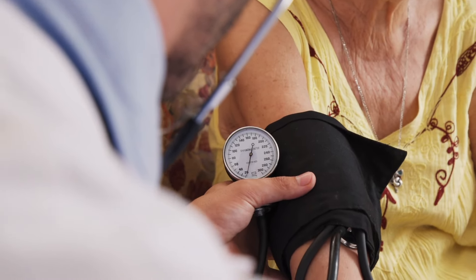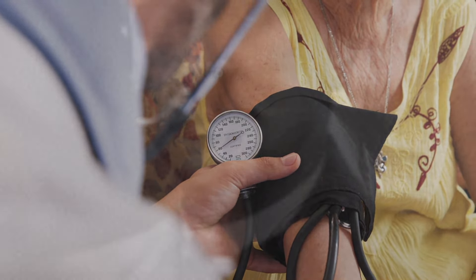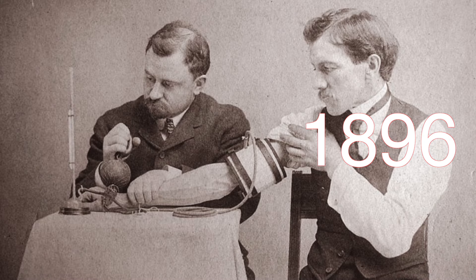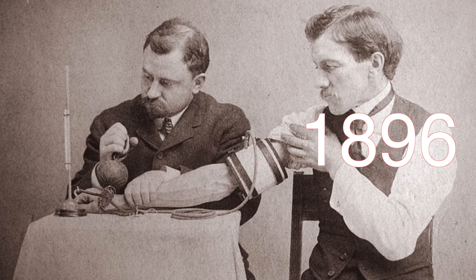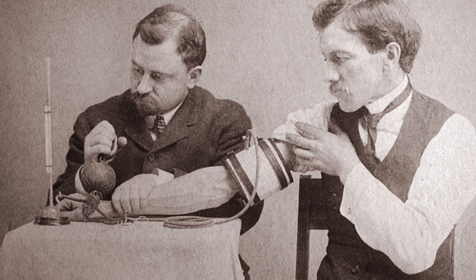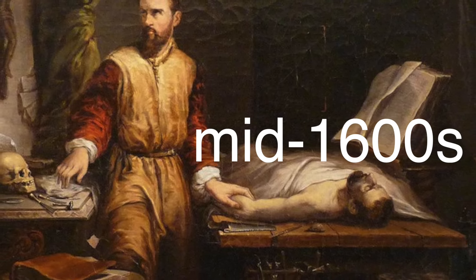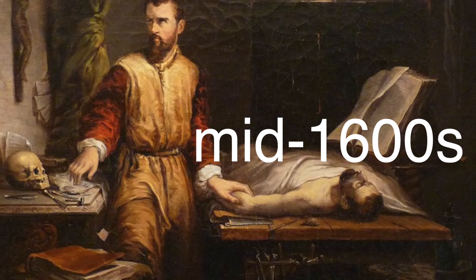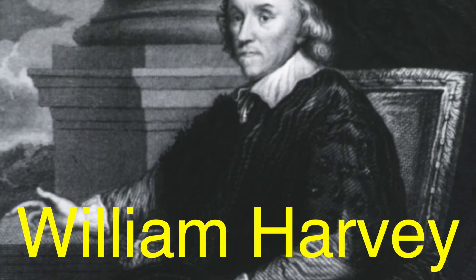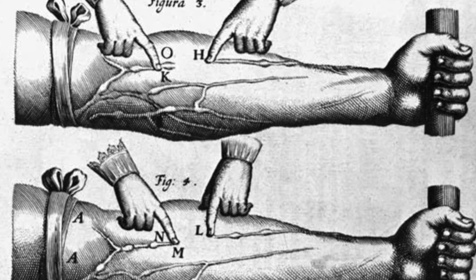The history of this device is surprisingly rich. The invention of the sphygmomanometer is credited to an Italian doctor named Scipione Riva-Rocci. Back in 1896, he developed the first clinically practical version of the device we know today. But the journey of measuring blood pressure starts a bit earlier. Let's go back to the mid-1600s, when physicians were desperate to understand how blood moved through the body. One of the earliest pioneers in blood pressure research was William Harvey, an English physician, who discovered the circulatory system and how blood was pumped by the heart.